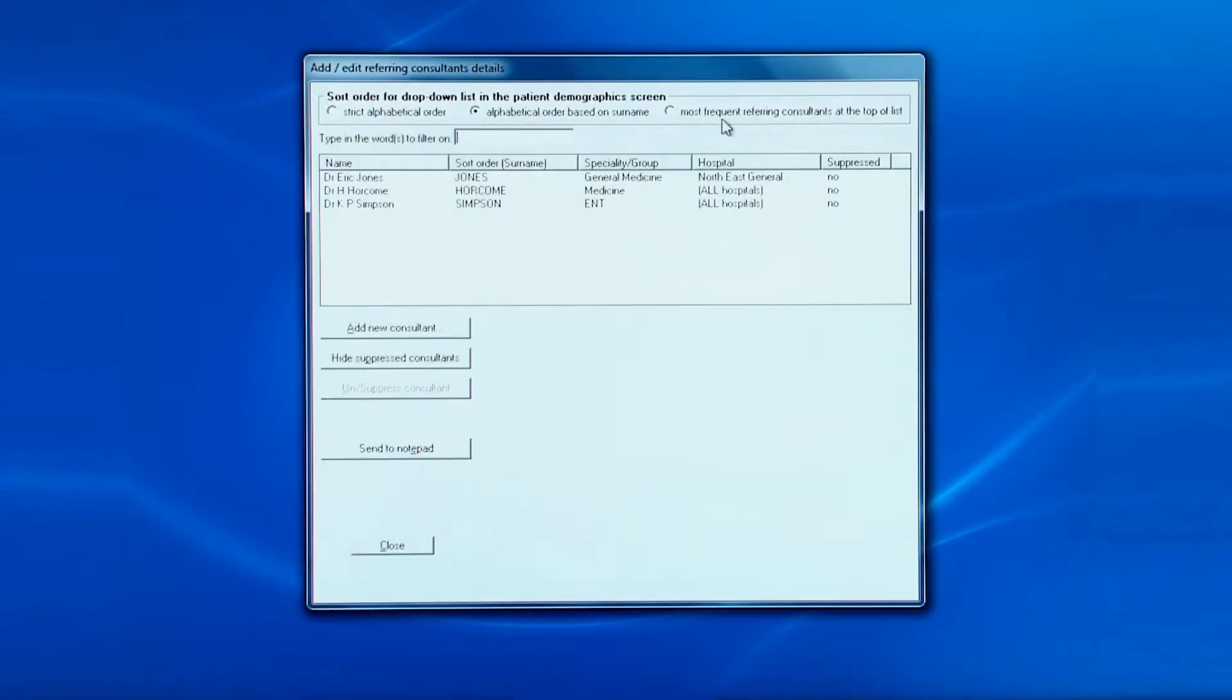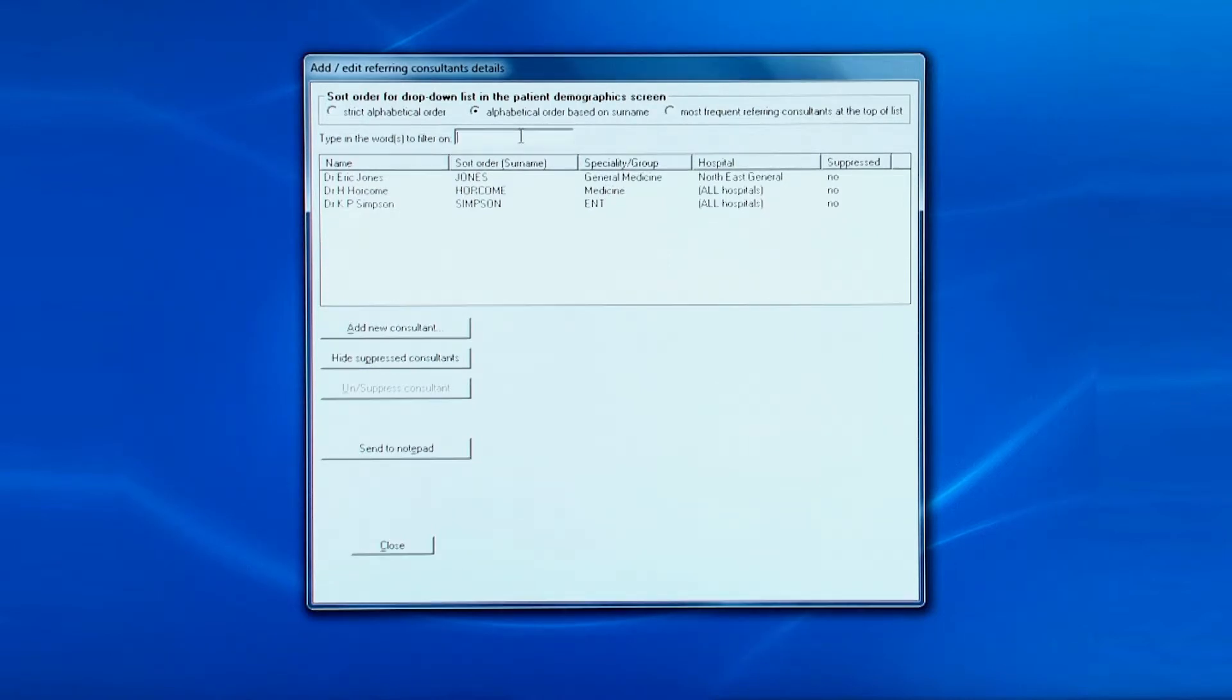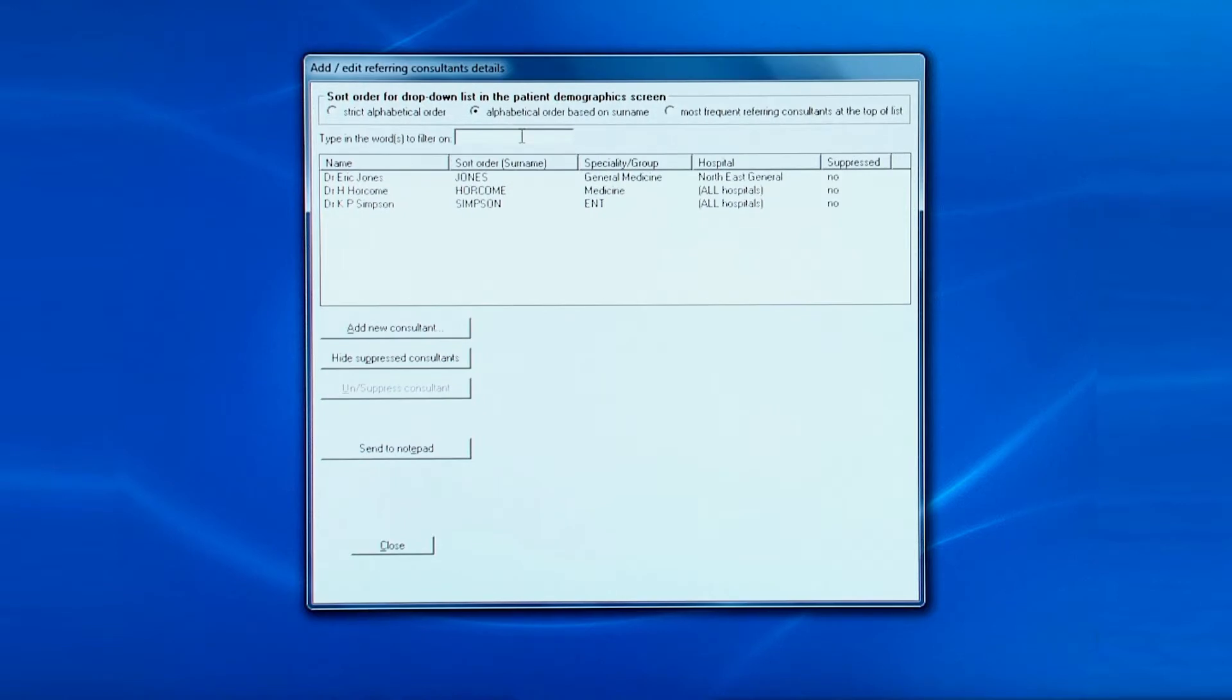You can have them in very strict alphabetical order, or ordered in an alphabetical order of surname, or have the list displayed with the most frequent referrals at the top. Beneath that you can filter the list of consultants to see whether one has already been added.